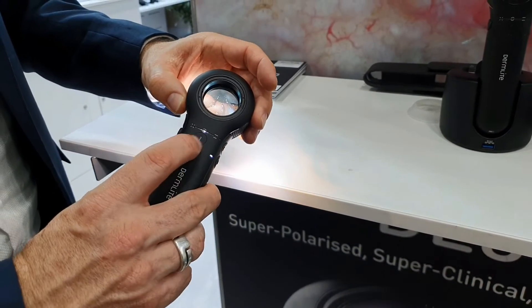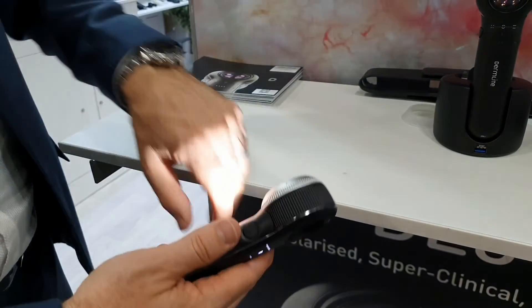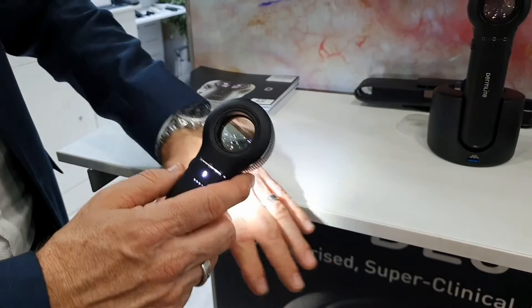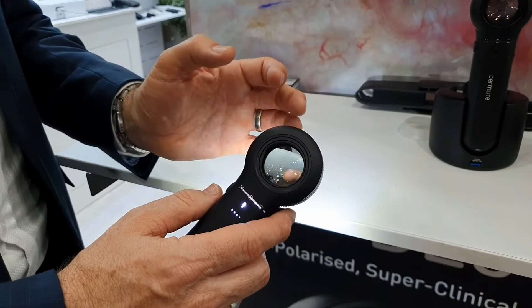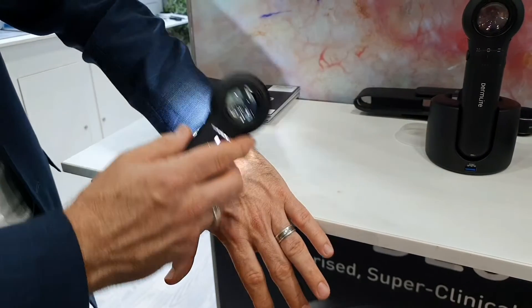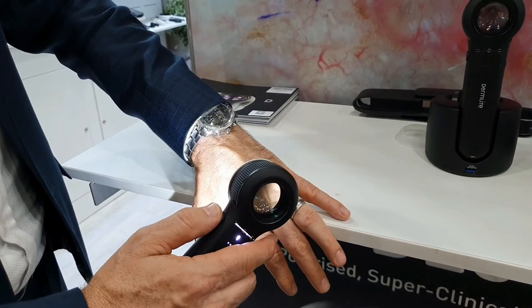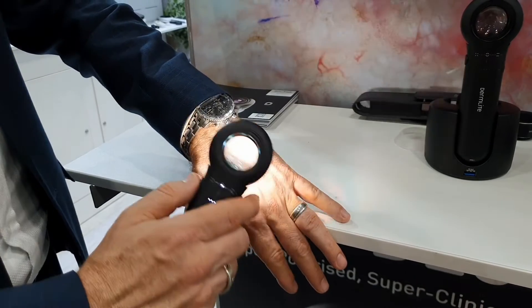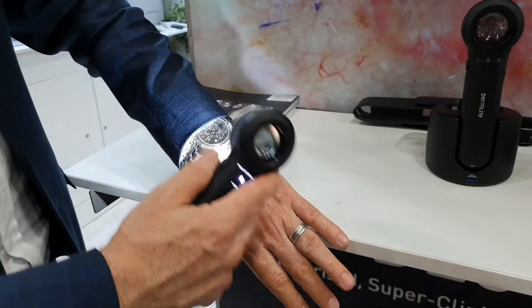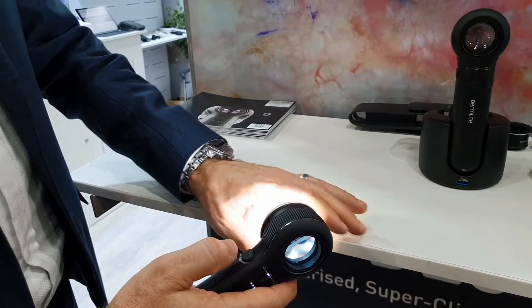We also have the torch mode here — this little button on the back — which activates a different LED on the front that acts as a screening torch. So instead of using your Dermatoscope where you get shadow from the polarized lights when scanning the skin, you can just scan the whole body. As soon as you're ready to go into Dermatoscope mode, press the power button and touch it to the skin, then back to torch mode. Every time you see a lesion, just press it down to touch the skin.